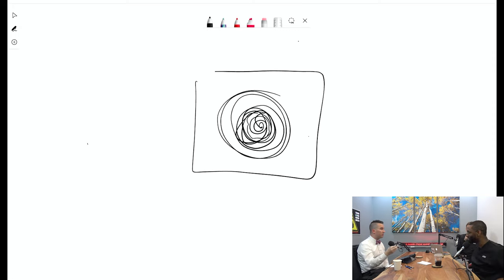Do you guys do that as well? Yeah, we actually do that technique. So you can put an ROI in, inject 1 cc of contrast, and you're able to see the arrival.